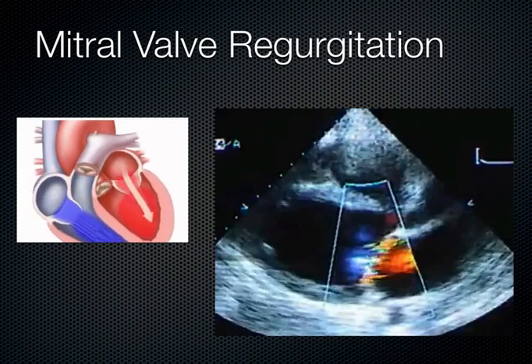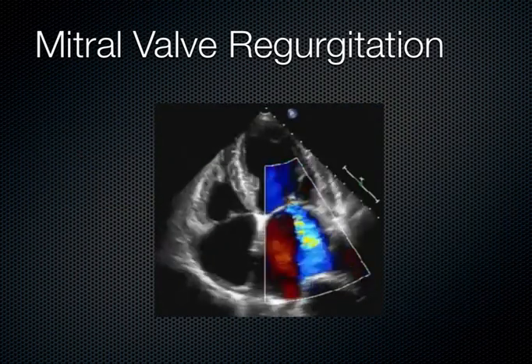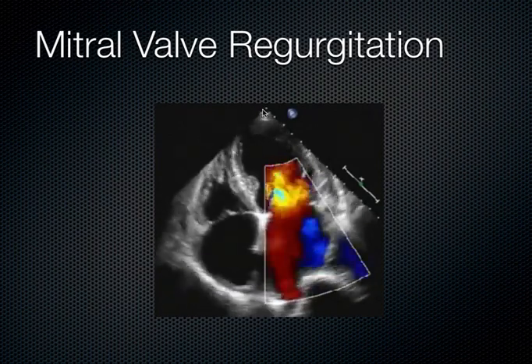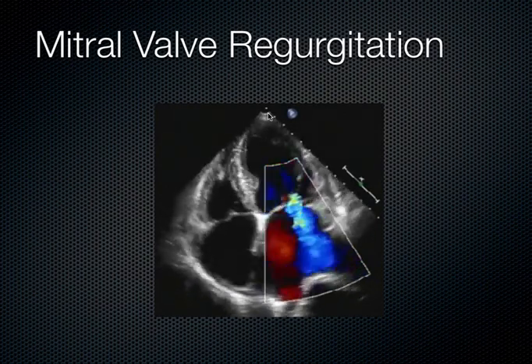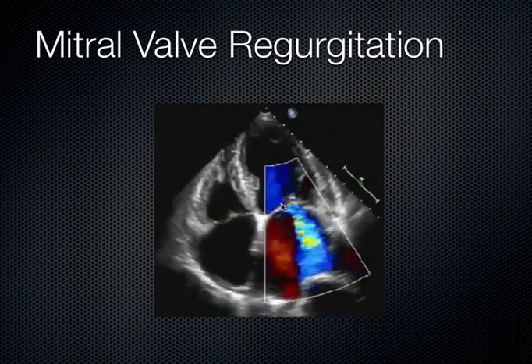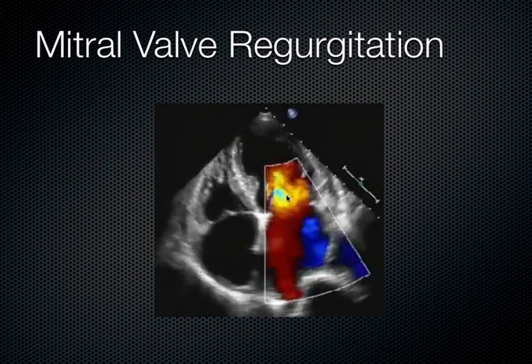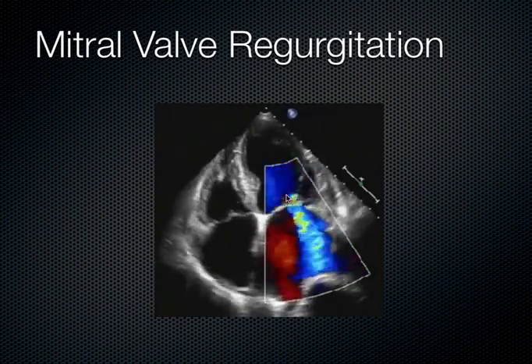Instead, a healthy mitral valve keeps your blood moving in the right direction. A leaky valve, I'll show you what I mean by that here. So this is the apical four-chambered view, and we see the LV is here, the RV is here, and the way the sound is aiming, you think about the probe as throwing the sound down the barrel of a gun. What I mean by that is now the flow is coming up directly towards the probe, more parallel to the sound rather than perpendicular, and that gives you a much more accurate assessment of what's happening with that valve in terms of color flow.